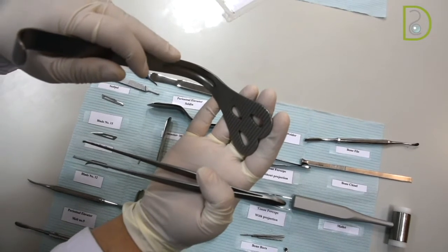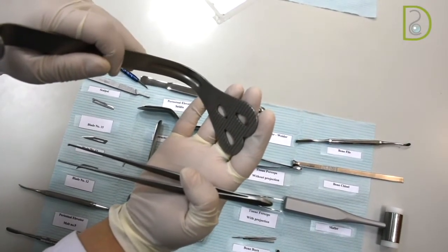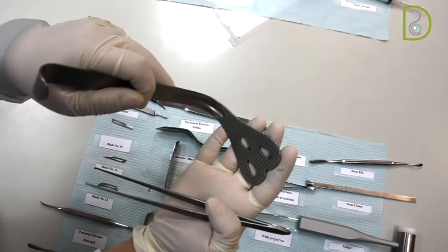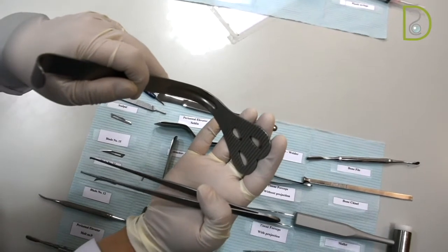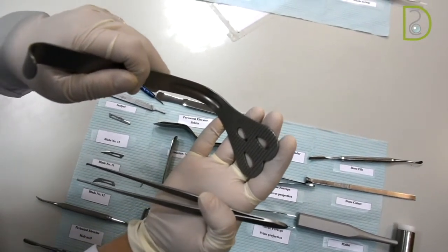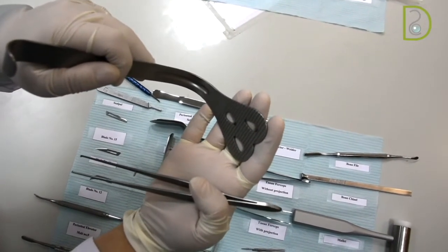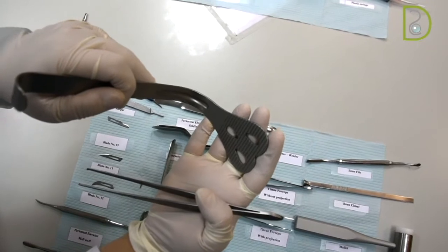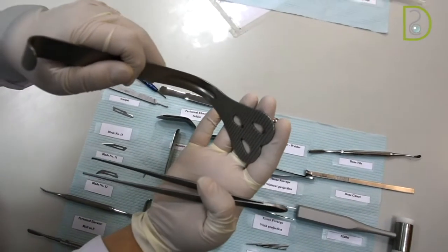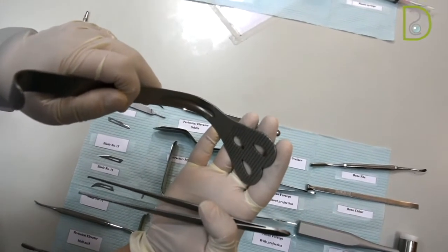It's not only for surgery. You can use it even for the most posterior teeth if you are making a simple class one, let's say, for example, on the 3-8 or the 4-8, and the tongue is so huge, like in macroglossia situations. So you need to retract the tongue in a very good and safe manner. So you can tell your assistant to use the Weider in this case and retract the tongue away from your surgical or operative site.